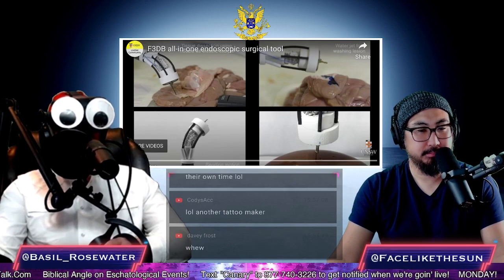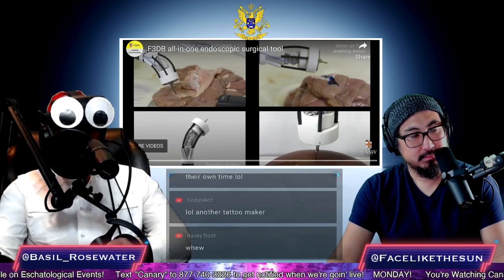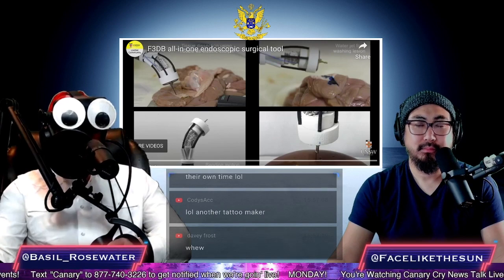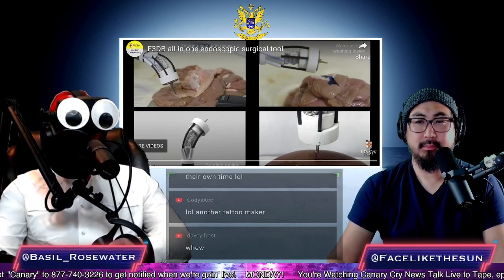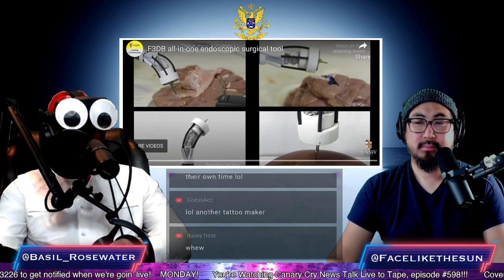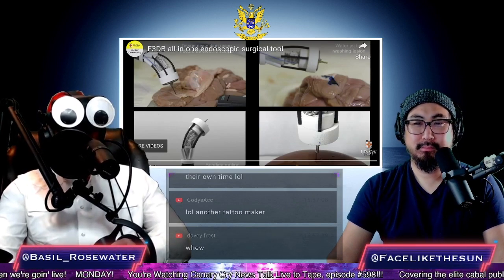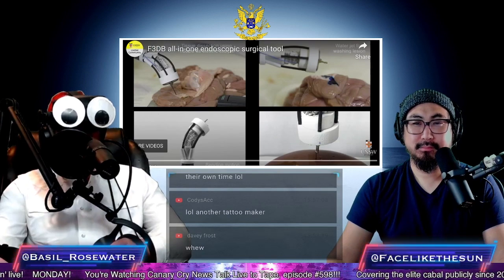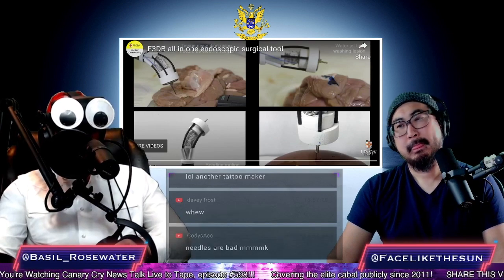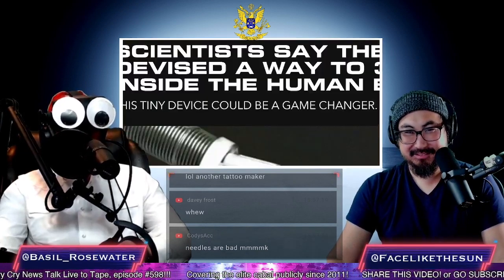That's true. Apart from bioprinting materials, the robot could also be used to remove certain types of cancer with the use of an electric scalpel, a needle-like instrument that can make incisions using tiny electric arcs. Water pumped through the nozzle could also be used to clean away blood and excess tissue. These various tools could be used at the same time. Whoa! The researchers suggest making it the ultimate all-in-one endoscopic tool that avoids the use of changeable tools, which are normally associated with longer procedural time and infection risk. As Maitan Tai, Doe's PhD student and collaborator, explained in a statement.